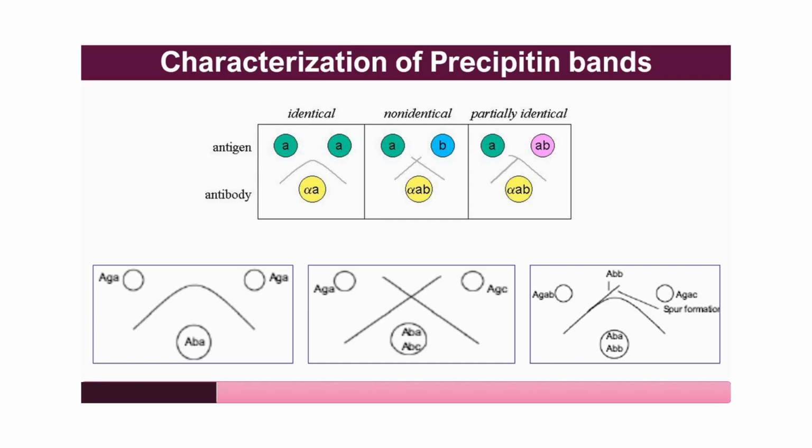Only thing is, because the concentration of antigen B and A is almost the same, the precipitin bands have overlapped with one another. Imagine if the concentration of A and B were different, then the precipitin band of B would have come separately without overlapping with the band of A. If the concentration of B was less compared to A, the precipitin band would have appeared closer to the antigen well.